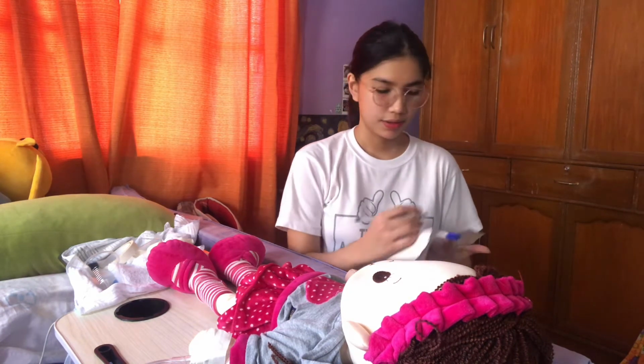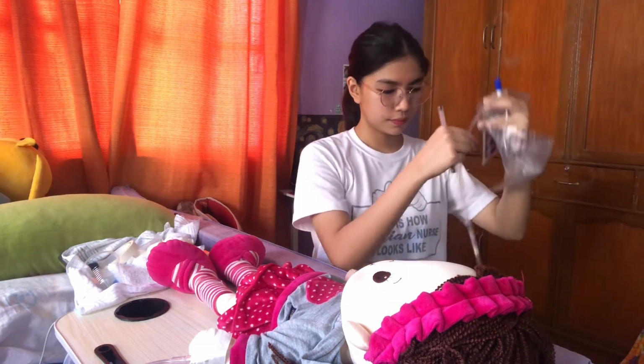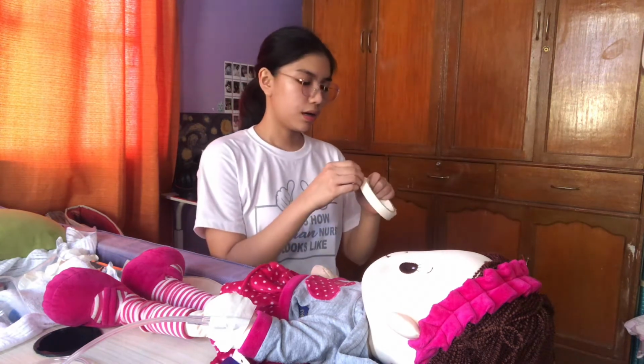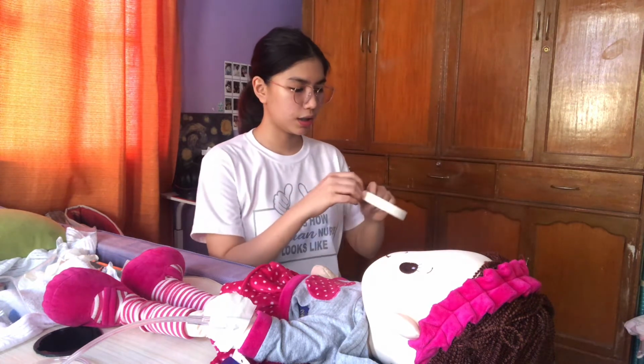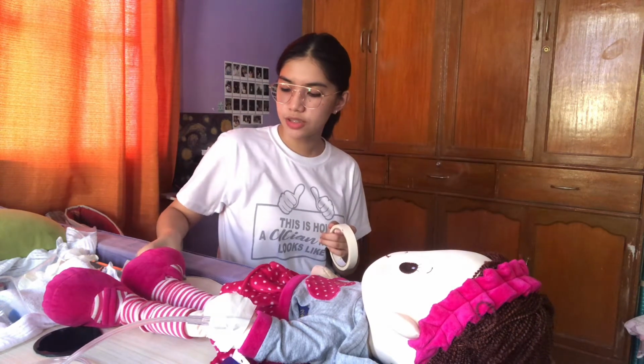Ma'am, excuse for a while. I'll be setting up the IV equipment and apply a timing label to the container, then prime the tubing and label it. Then prepare the IV needle or catheter tape and the dressing equipment. Prepare strips of tape as needed for the type of needle or catheter. So I'm just gonna hang the pieces of tape from the edge of the table.